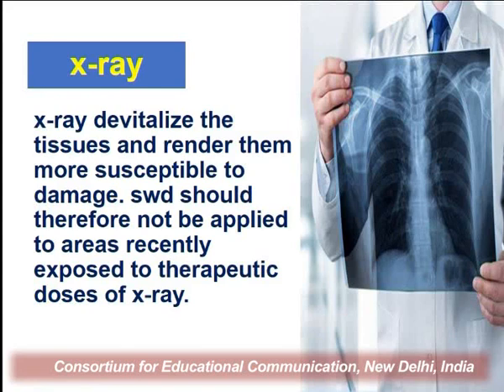Then X-ray. X-rays devitalize the tissues and render them more susceptible to damage. So, shortwave diathermy should therefore not be applied to areas recently exposed to therapeutic doses of X-rays.